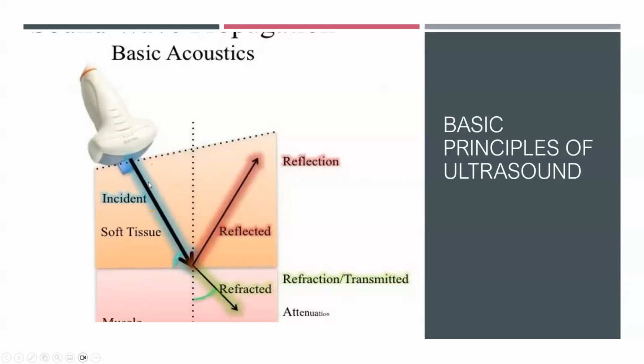So a sound wave, once it hits tissue, rather than being just reflected back, will also get refracted. Some of its energy will dissipate while it's reflected back, so that refracted wave has less energy. More importantly, this ultrasound wave will interact with the tissue. If you assume skin, meninges, and then you hit brain tissue, what is happening is that it's losing its energy because of absorption from the tissues. So actually, that sound wave is becoming attenuated. The brightest areas of the brain are usually the skull. There's a lot of reflection back from it, and it's the fontanelle which allows most of the sound waves to penetrate in. And for that reason, we have a very small window where we're going to get the best image quality.